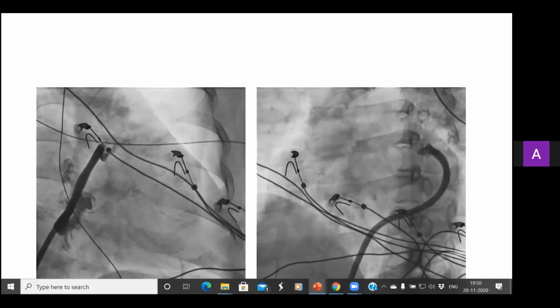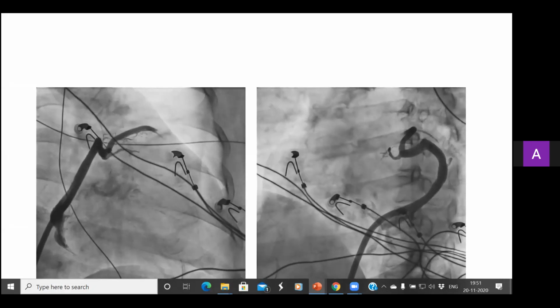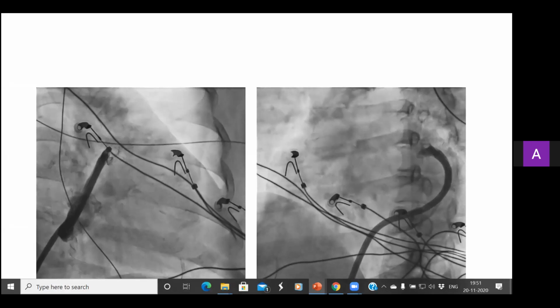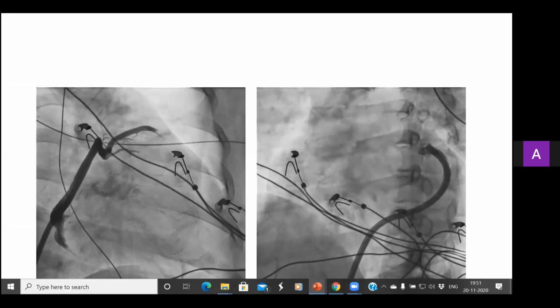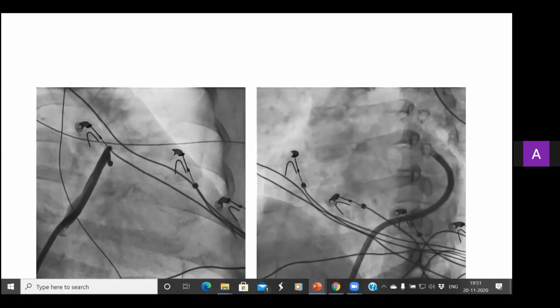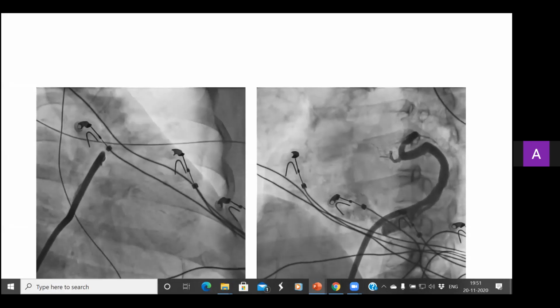The interesting fact about this vein, which drains into the GCV, is that it is devoid of perivascular fat and it sits directly on the epicardial surface. It could possibly be a potentially safe as well as effective site to ablate arrhythmias of basal summit origin close to the proximal coronaries.